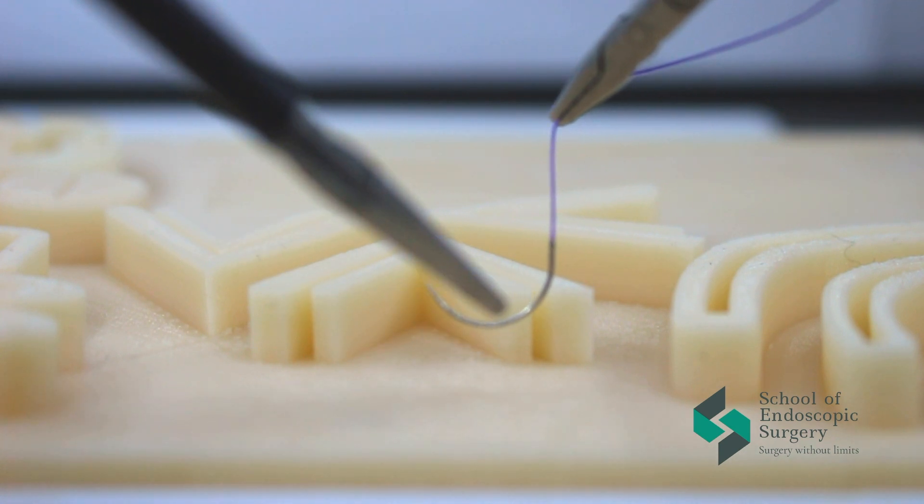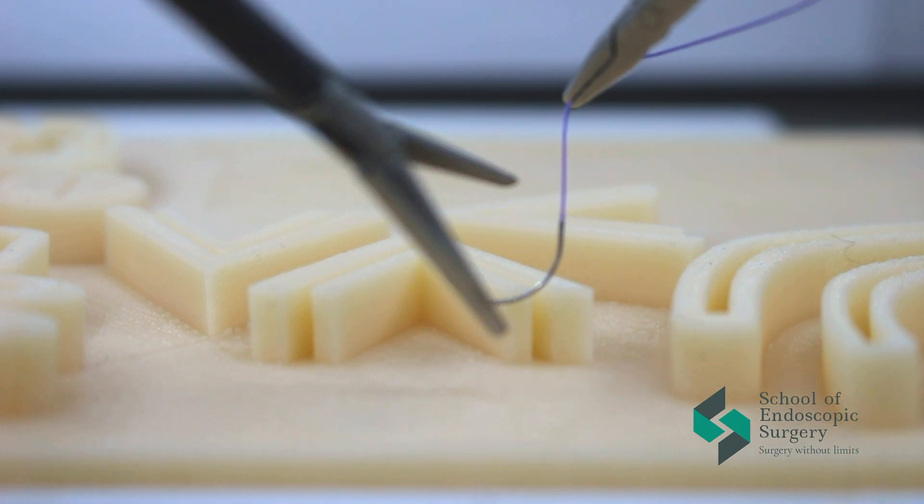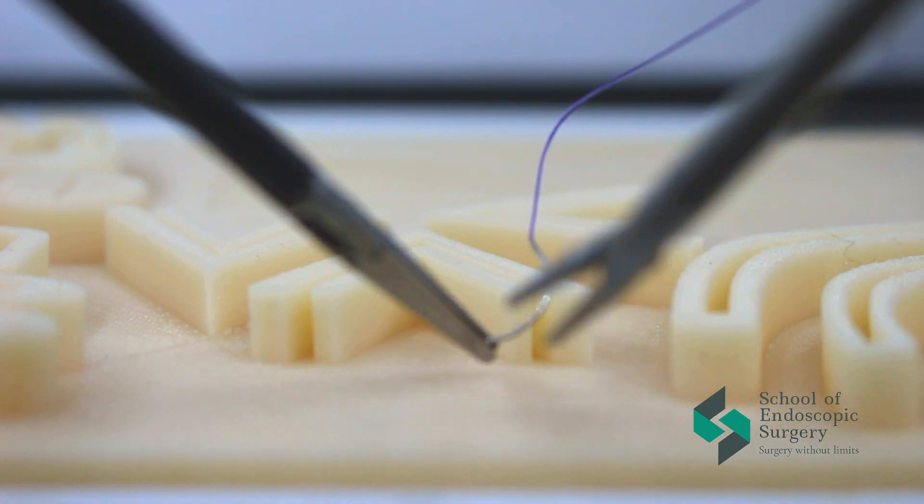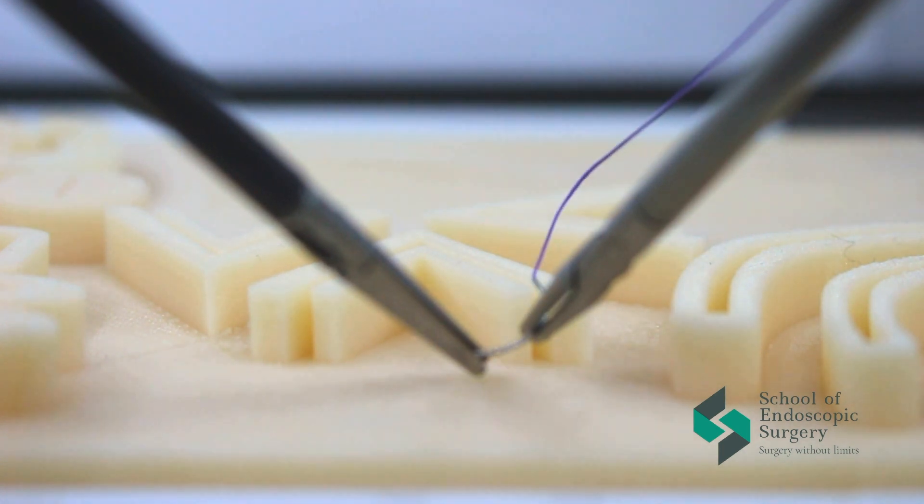Hello everyone! Today's lesson is about the extracorporeal knot. This knot differs from the intracorporeal knot in that it is formed on the outside of the endoscopic box.